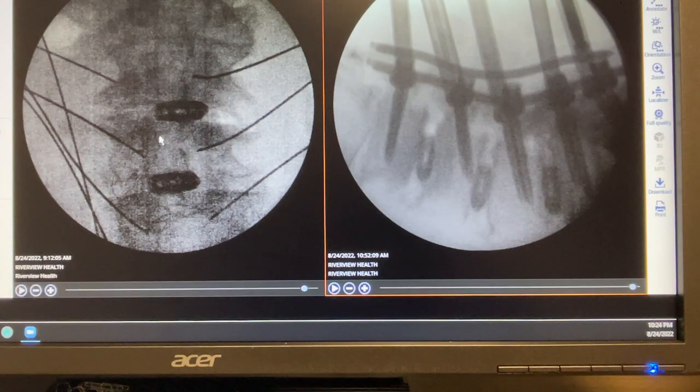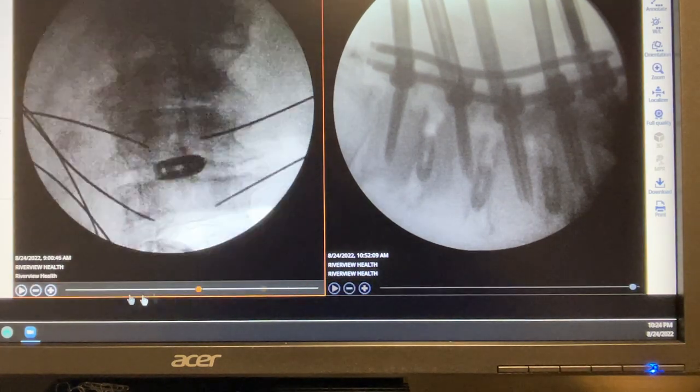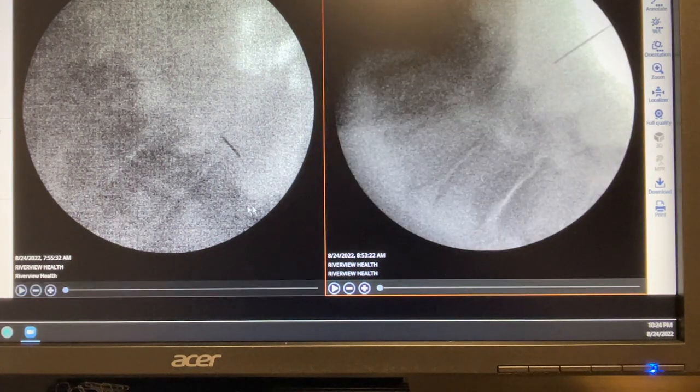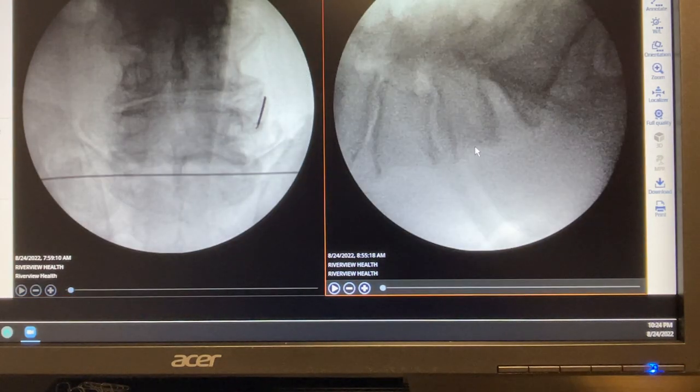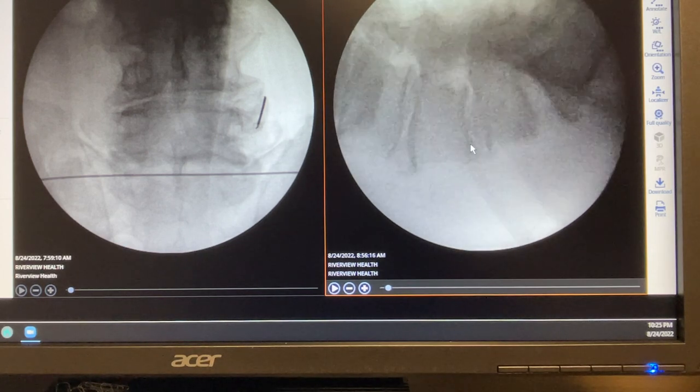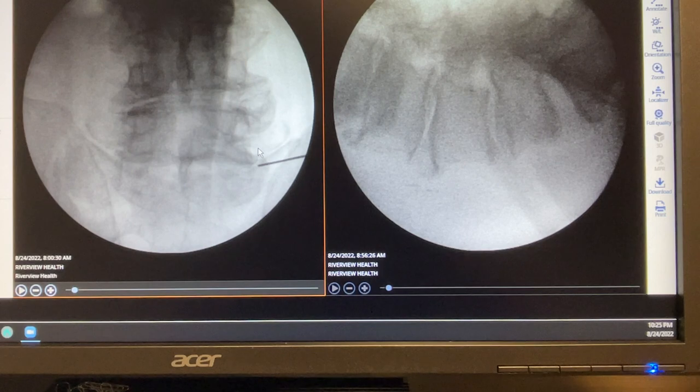These are the intraoperative films I'm going to show. With the high BMI, obviously imaging is going to be difficult, but with some technique we can get good intraoperative X-ray in the lateral view.